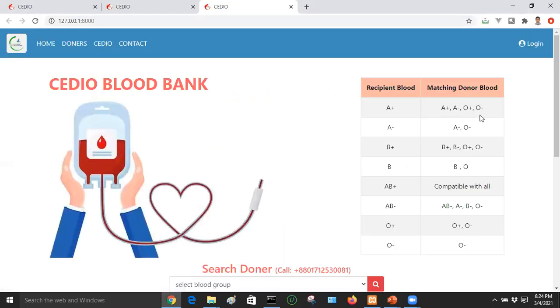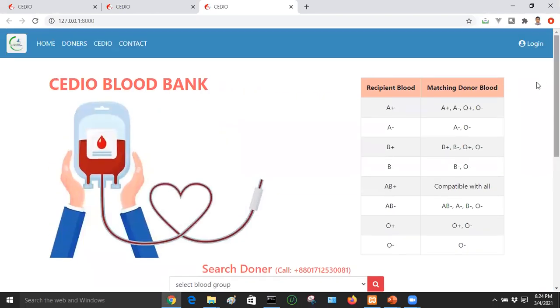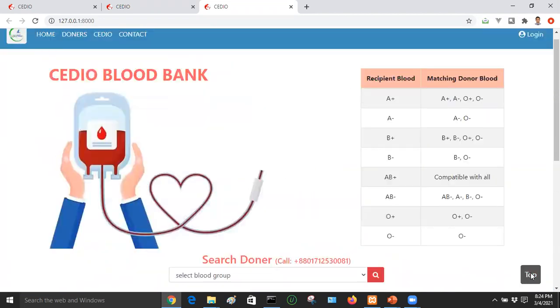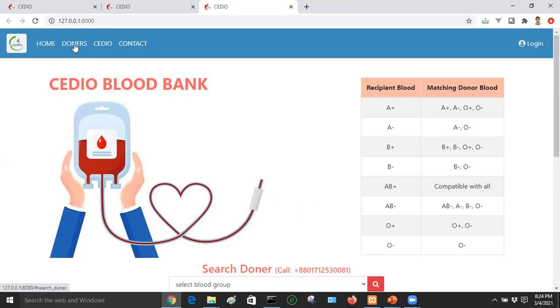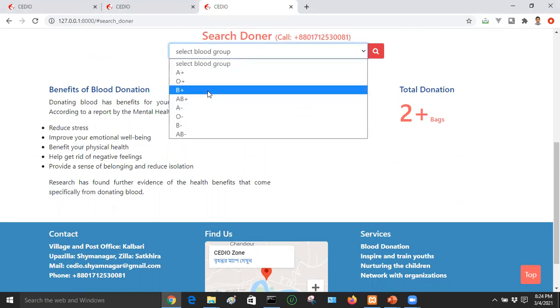Let's look at the information on blood type matching. If you have a blood donation, you can see blood in the last checkbox and view the interface in the next step. When you start the donor search, click on the donor search option. We are going to search for a donor — we need to select which blood group. We have selected B-positive.